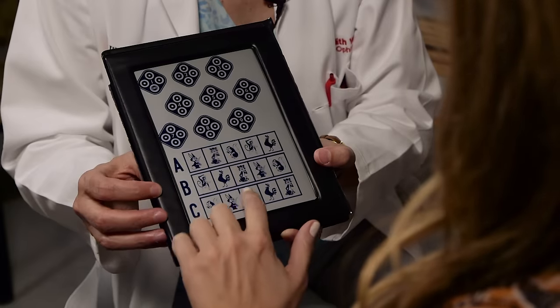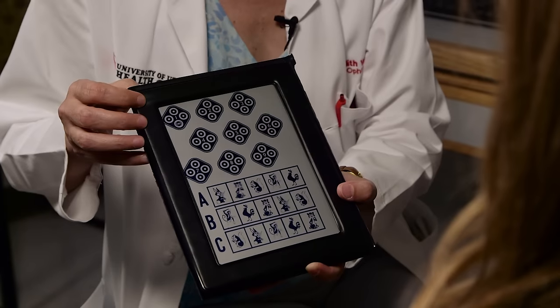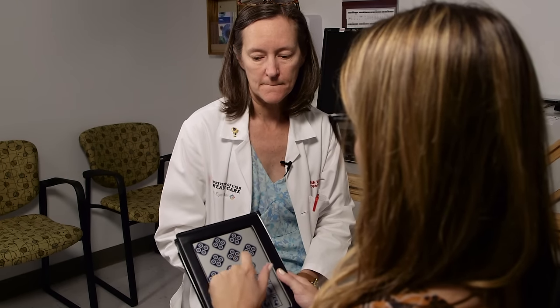I usually do the animals first. In each row there's one animal sticking up off the page — can you point to or tell me which one? Excellent, fast and accurate. Now in each set of four circles there's one sticking up off the page — tell me or point to each one. The patient identifies them. The last one's really hard — give it a whirl. Excellent, very well done. I like to see somebody who's really trying doing that movement of the plates — that's what somebody with depth perception does when trying to see three dimensions.